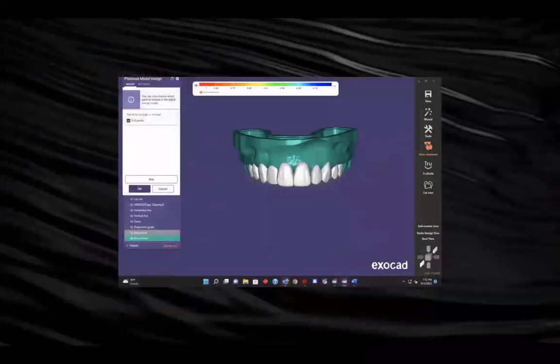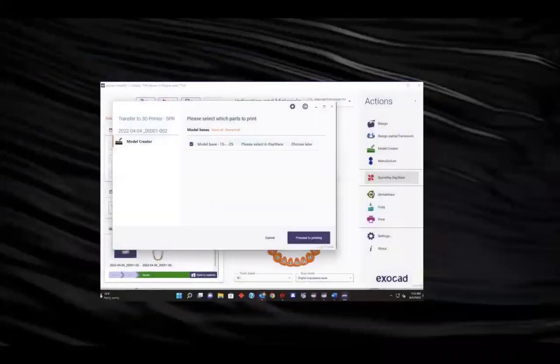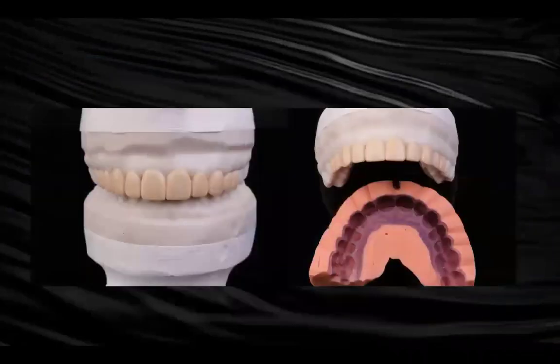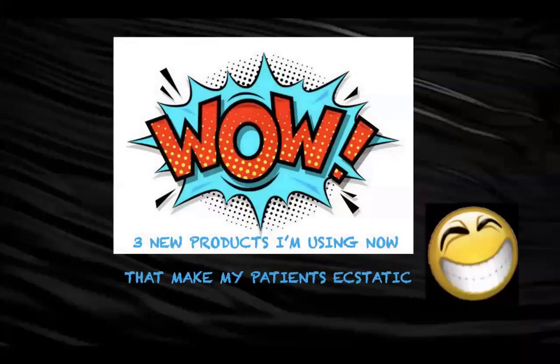So we create the models, and it's very, very simple to do. Kelly travels so much, so we didn't do the mock-up on her because she was already sold on it anyways. But I sent the design to MJ, and we went ahead and we were able to create her smile. And we're double checking our stuff.